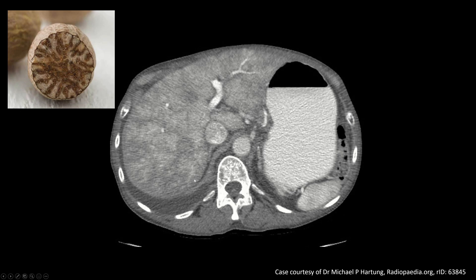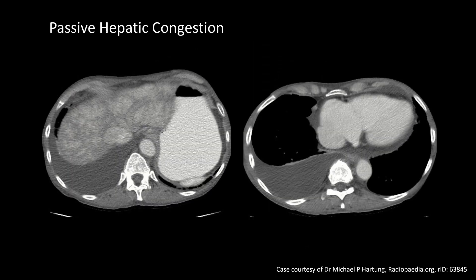There are three groups of conditions that you need to know that can lead to this appearance — things commonly confused by trainees, so it's worth reviewing. First, and relatively common, is passive hepatic congestion. These are patients with cardiac disease of some sort, usually right heart failure, with increased central venous pressure that causes venous congestion in the liver and this nutmeg appearance in the liver parenchyma.